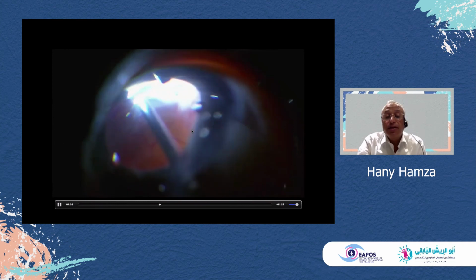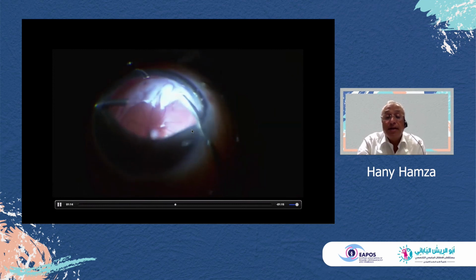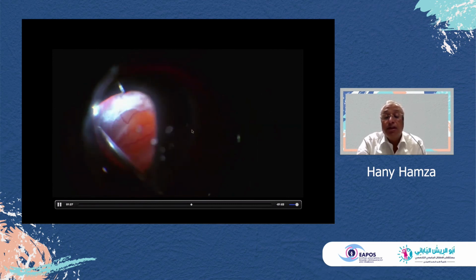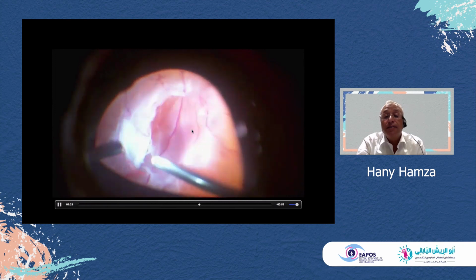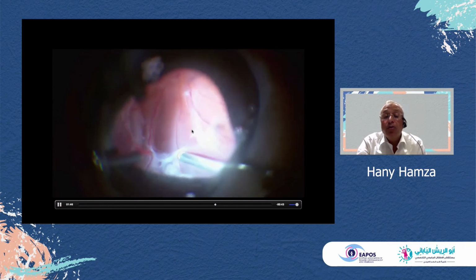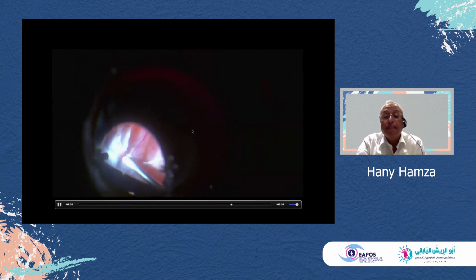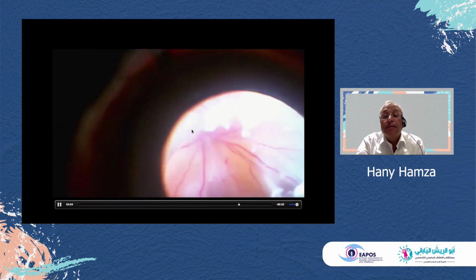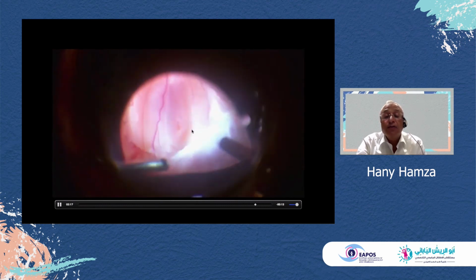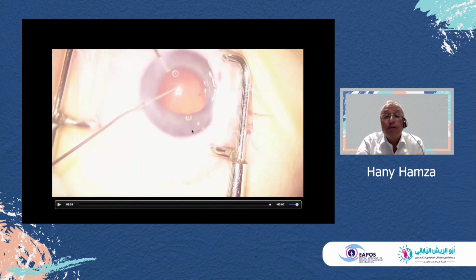It is worth mentioning that it is impossible to remove all fibrous tissue in these children, and attempts at vigorous dissection in these eyes can end up with iatrogenic retinal breaks and surgical failure. We just remove the necessary traction, which needs extreme caution and wisdom to know which traction components to tackle and which ones to leave. Again, after removing the fibrous tissue, the retina remains detached at the end of surgery, and it takes several weeks until the retina reattaches again, usually with folds in these cases.